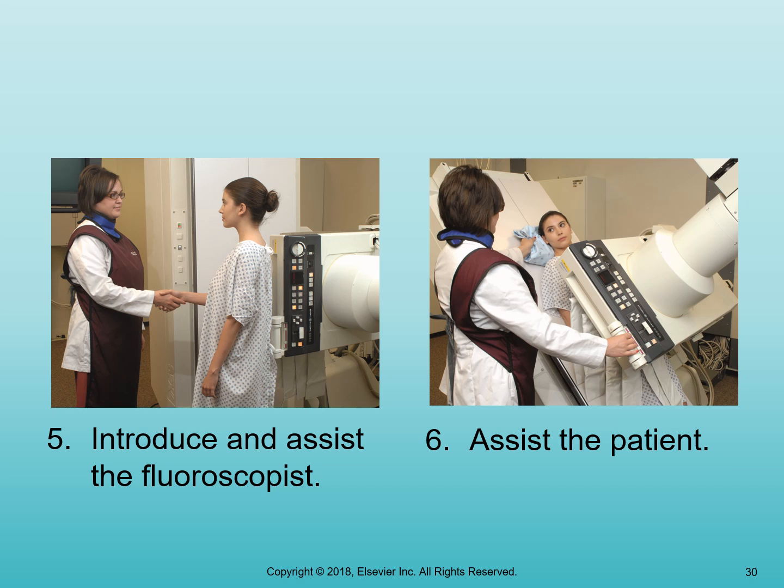It's usually marked or annotated with the word scout because you're kind of scouting out what the patient looks like before you give them the barium. So those images have to be taken prior to and cleared by someone with more authority, typically a lead technologist, or the radiologist will clear those images before we begin the procedure.